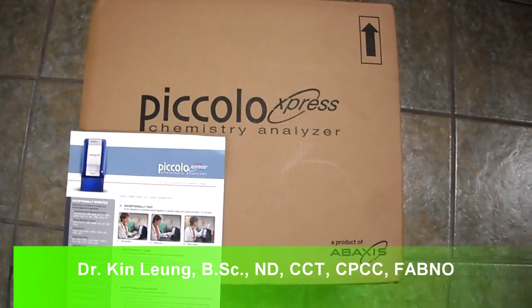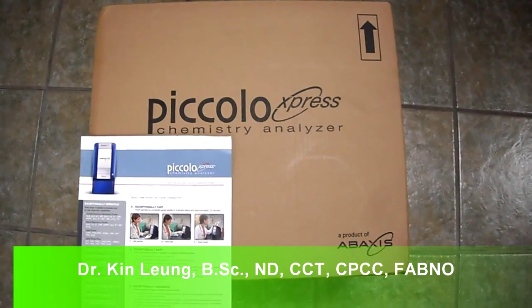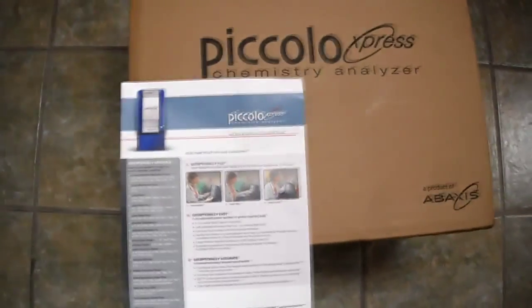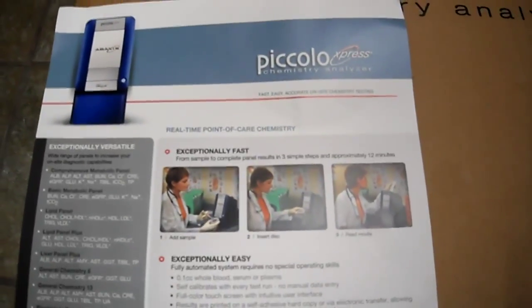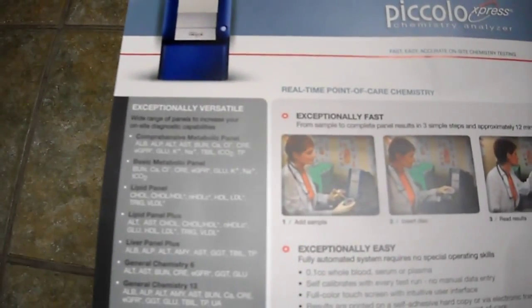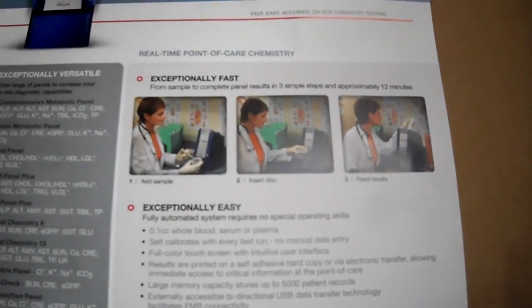Today I'll be doing an unboxing of this new medical device — the Piccolo Xpress chemistry analyzer by Abaxis. If you've never heard of it, it's a portable blood chemistry analyzer. It measures blood tests; for example, if you look here, it'll do a comprehensive metabolic panel, which includes liver enzymes, kidney function, potassium, and sodium, just to name a few.